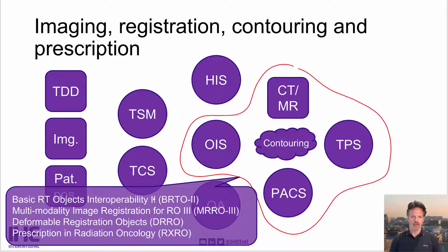to each other. There's deformable registration object, which deals with registration of images that also have deformation in them, like between different times. If there's one CT image and a later CT image where the patient has changed, it's oftentimes necessary to define exactly how the anatomy changed, and that's then a deformable registration.